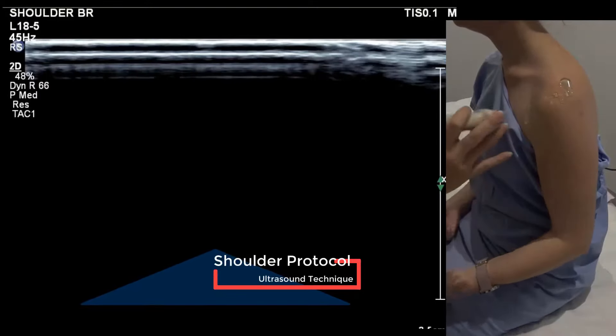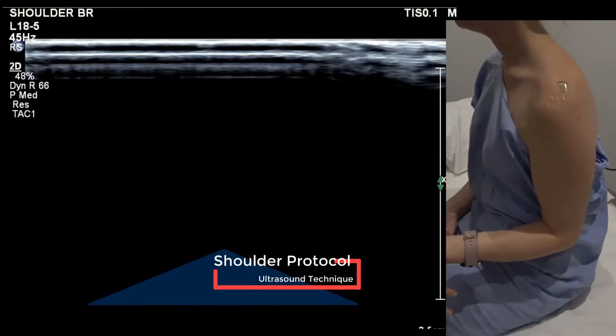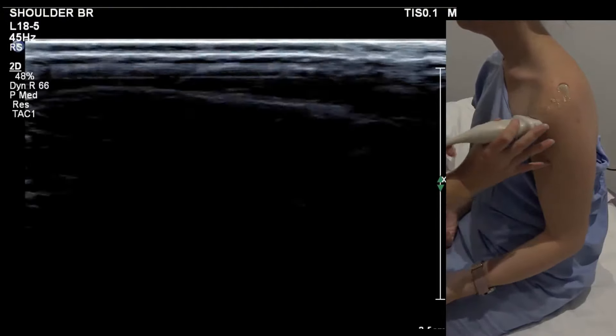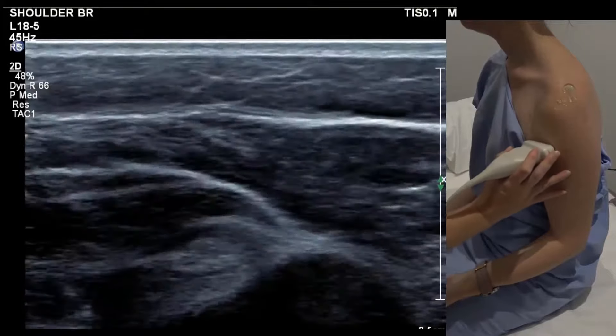We'll run through a routine shoulder series. The position for the biceps is on the thigh, but a little bit of external rotation is helpful. We're going to start in a transverse plane.